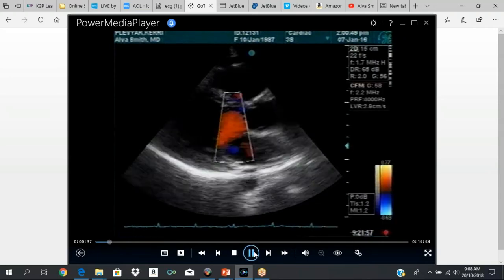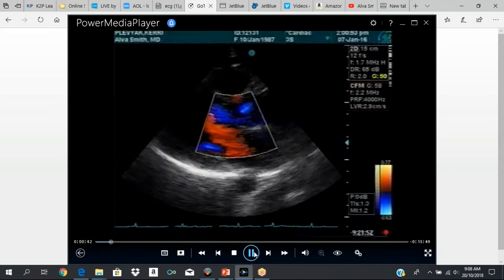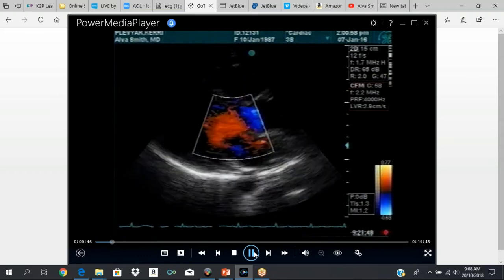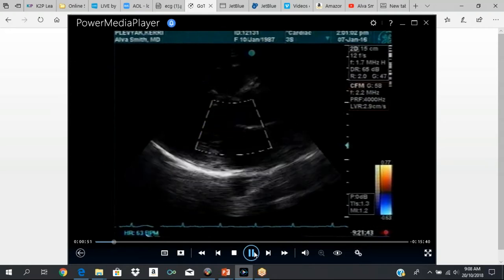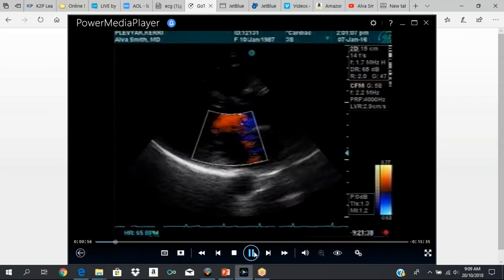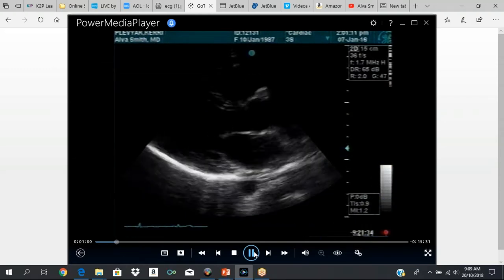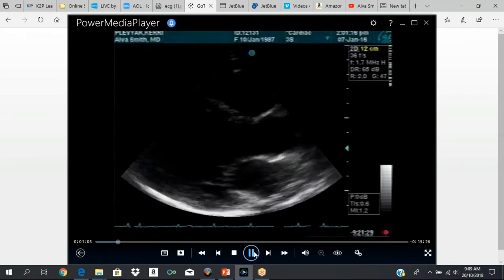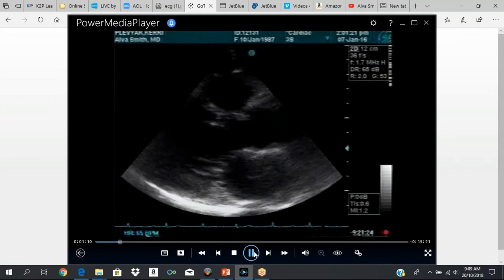This is your parasternal long axis view. We're not teaching Doppler today, so we're just going to ignore the color flow Doppler. In the parasternal long axis view, you're going to do your measurements — the diastolic measurements and the systolic measurements. You have to know which measurements you do in diastole and which measurements you do in systole.